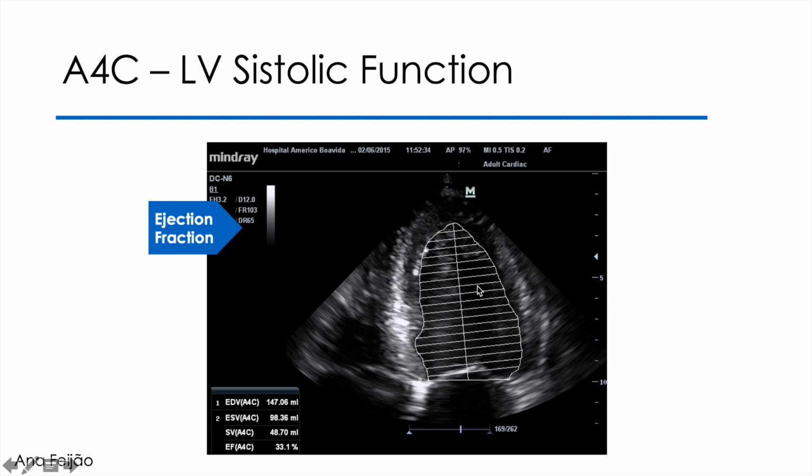When giving OK, the software automatically defines the mitral annulus as a straight line that joins the 2 points of the mitral annulus, and also automatically launches a longitudinal cursor that we must align with the major axis of the left ventricle, that is, with the length of the cavity.